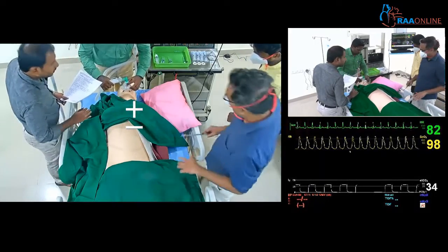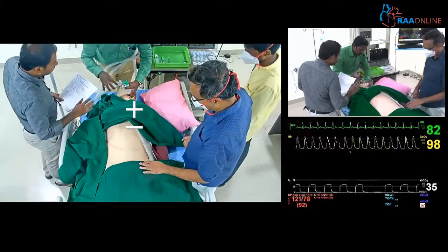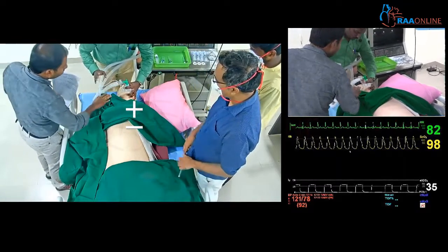Okay, sir. Please make it faster. Yeah, I am pre-oxygenating, sir. You pre-oxygenate the patient. Yes, sir.